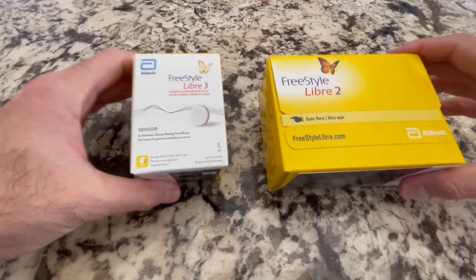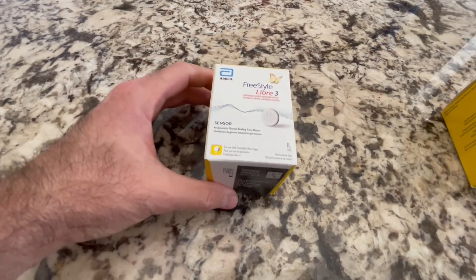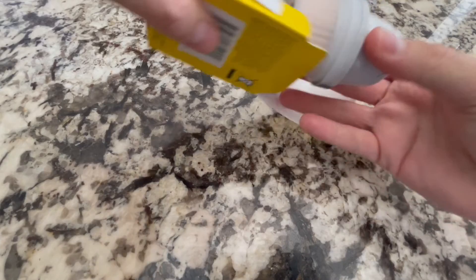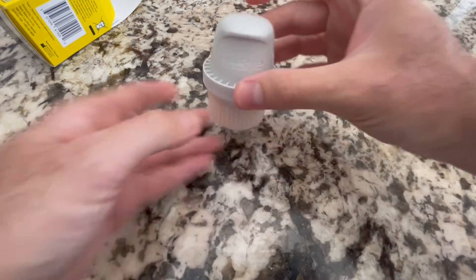First, let's talk about the packaging. You can see that the box for this thing is way smaller compared to its predecessor. Definitely some bonus points for making this a little bit more environmentally friendly using a little less packaging. How is it that they can make the packaging so much smaller? Well, first, you no longer have two separate parts for the sensor — it's all built into one convenient part, which eliminates a step in the process of putting it together.